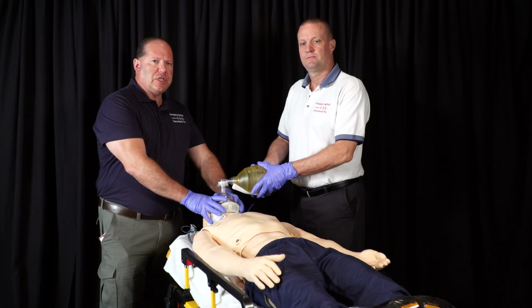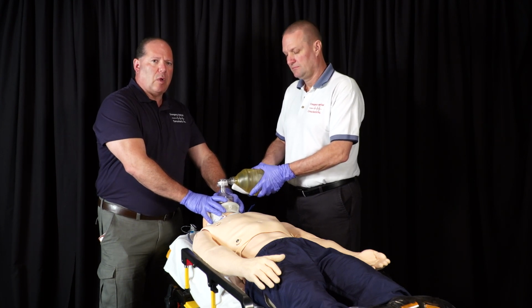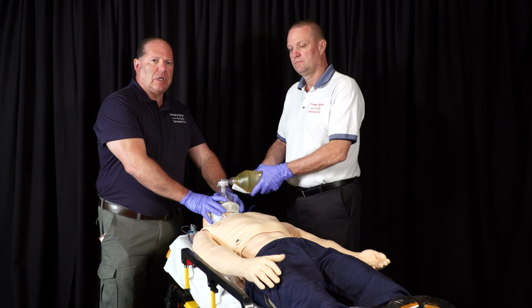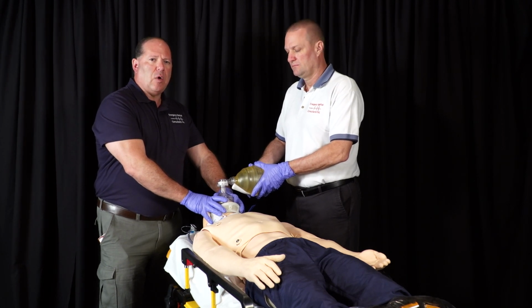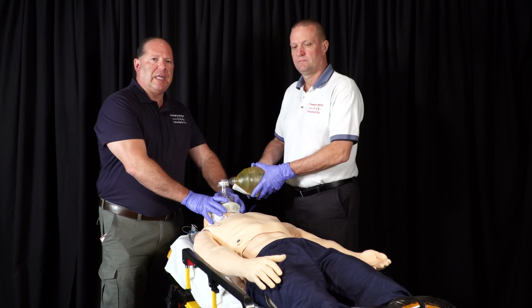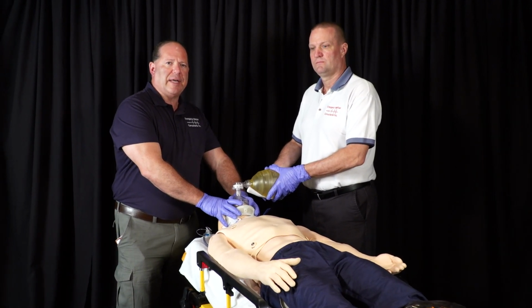So once the decision is made to intubate the patient and the equipment is gathered, one person will hold the C-spine in the neutral position from the front while the second person intubates the patient. The goal is to keep the spine neutral and use the laryngoscope to move the jaw anteriorly versus manipulate the head. So while I hold the spine neutral, sometimes releasing the front of the collar allows the jaw to move more freely. However, you have to be very cognizant about not letting the neck move when you do that.